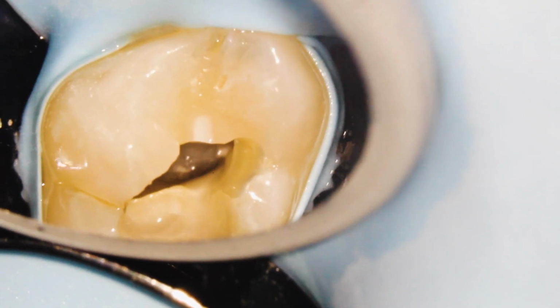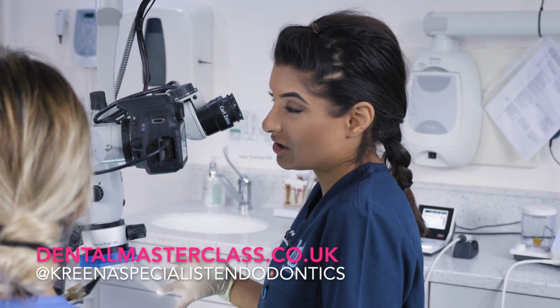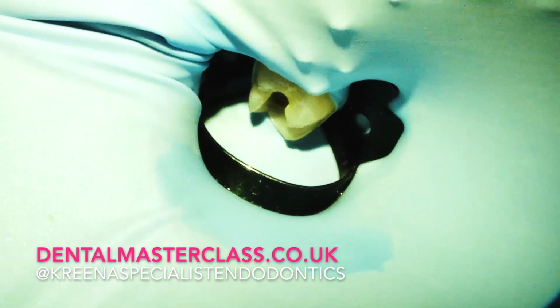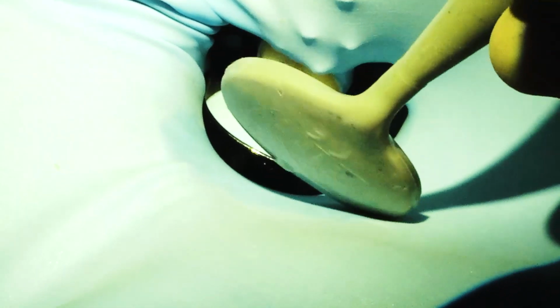So all our files are passing through the pool of irrigant, carrying sodium hypochlorite into the canals. It's also really great because we then don't get leakage of hypochlorite into the mouth, which you can get quite easily if you've got a DO restoration, because the rubber dam doesn't sit very well there. It provides good stability for our temporary restorations if we're doing things in 2 visits. And prevents saliva also leaking into your access cavity and contaminating things.